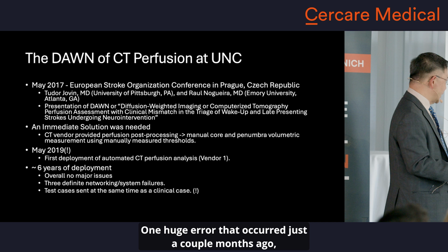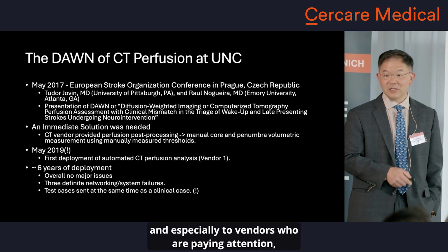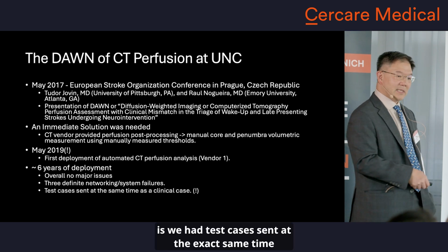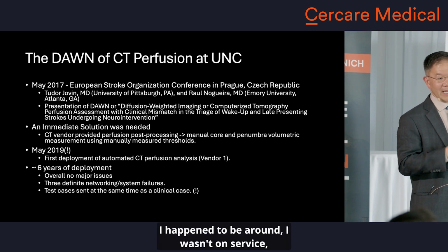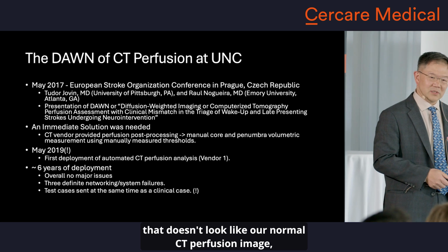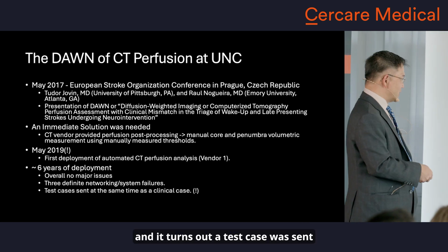One huge error occurred just a couple months ago, which I will raise as a major issue if you're going to do this, and especially to vendors who are paying attention or you're working with vendors: we had test cases sent at the exact same time as a clinical case. The neurologist didn't recognize it. I happened to be around. I wasn't on service. I was looking at it going, that doesn't look like our normal CT perfusion image. Something's not quite right. I spent the next half an hour digging into it, and it turns out a test case was sent to test our communication system.